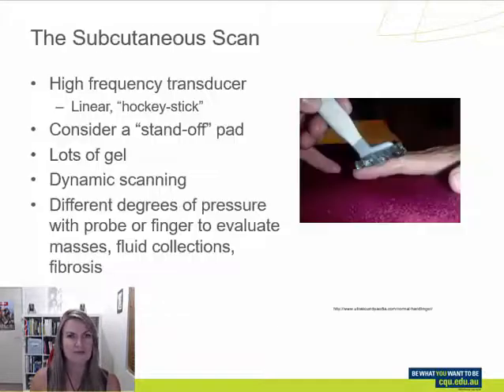So that's muscles. What about the scan? Well, as I said, could be anything. Could be the neck. You could be doing somebody's back, their finger. It could be bony structures around the elbow, anywhere that we can basically hit, get hematomas or bruises, or something could sting and leave a sting left in. Anywhere in the body we could be looking at. So again, we do have to be creative.